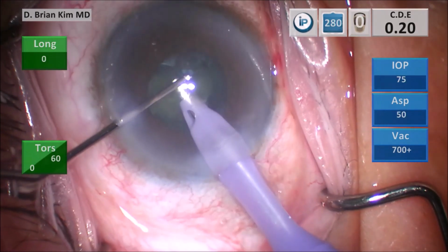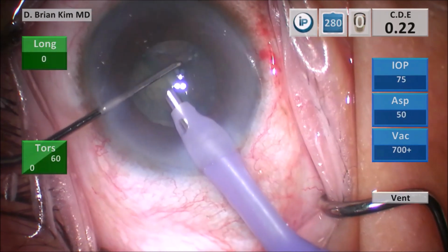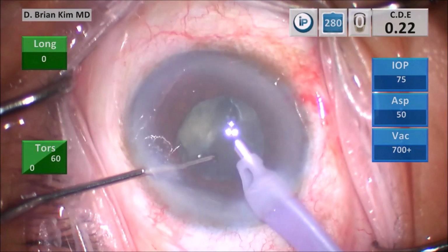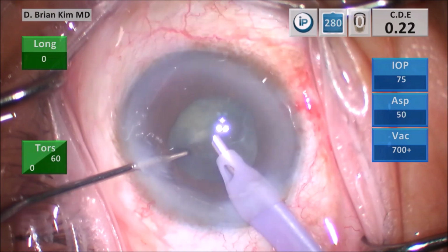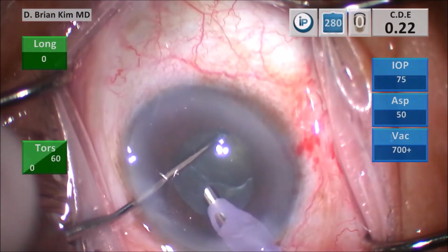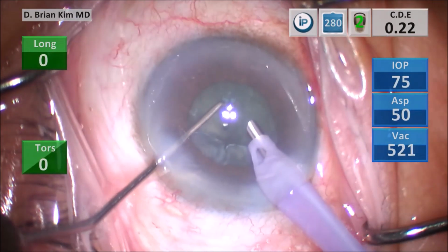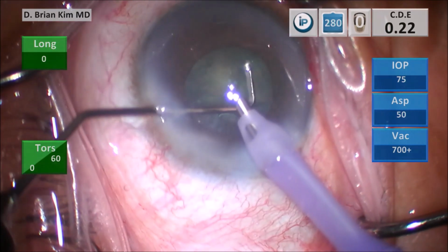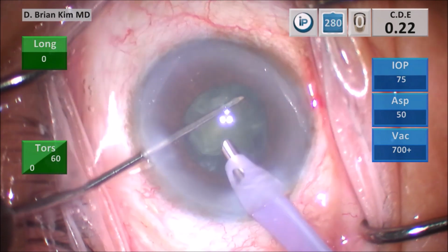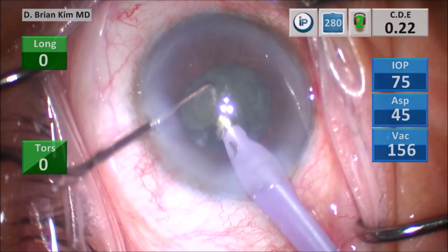I slide the chopper out into the capsular fornix, and then I place that phaco-tip deep, and then I'm able to crush the lens pieces. So the key is to make sure I'm underneath the epinuclear shell. And you know this because after I remove all the lens pieces, I often have a very robust epinuclear shell, especially on these cases, not talking about the very dense lenses. Because I have a robust epinuclear shell, that means I am always underneath the epinucleus when I'm doing my chop techniques. So even with these small pupils where you're worried about where is my chopper, where is it?